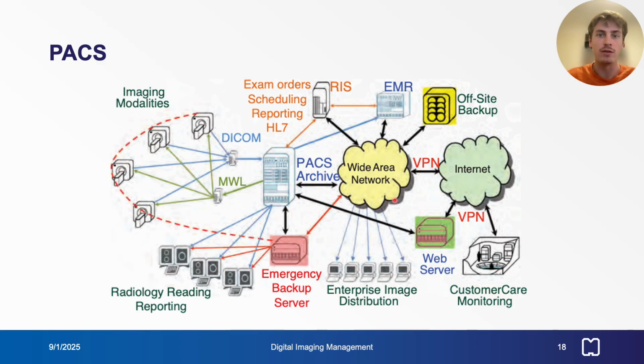Modern PACS uses a web server connected to the internet and a thin client paradigm to allow referring clinicians without access to the medical enterprise network to obtain images and reports over the internet. Users within the medical enterprise have access through local and wide area networks.